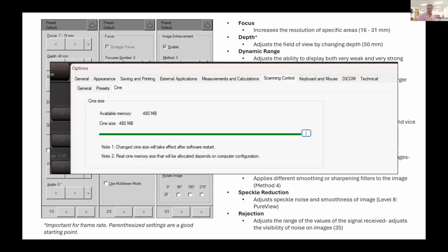Is there a way to add a universal timestamp to the imaging from the ultrasound setup? That's a really good question. I'll have a look and get back to you. I haven't really worked with this outside of a motion capture setup where we've got sync signals being sent from one device to the other.